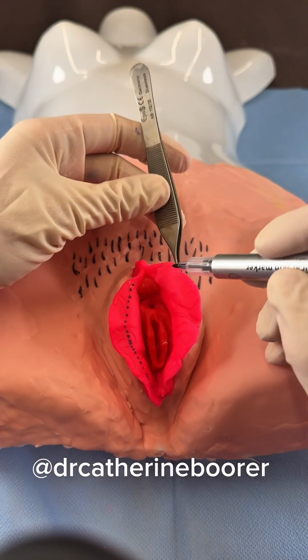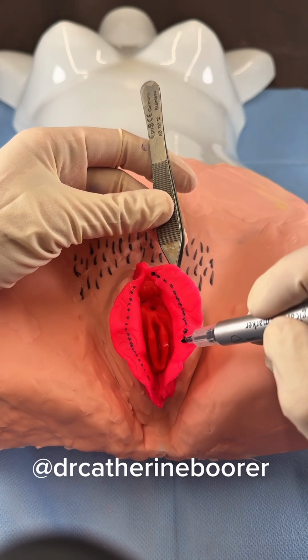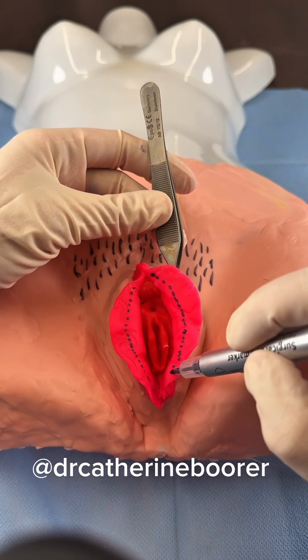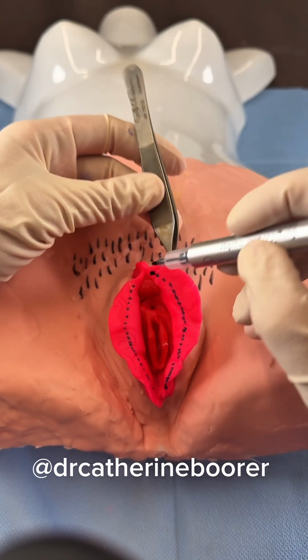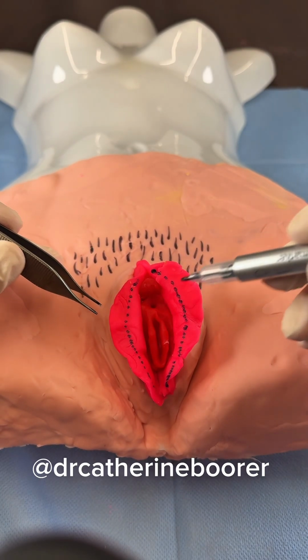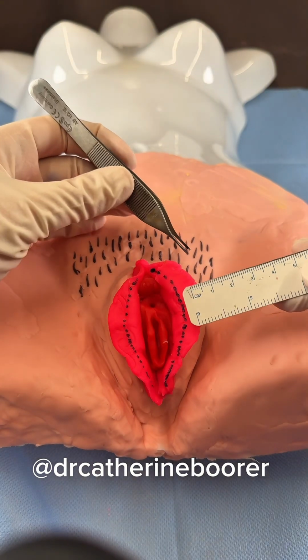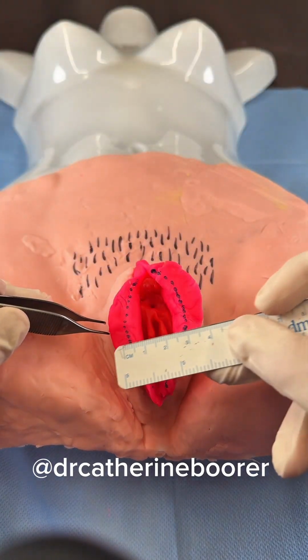First step is to mark where we're going to incise. And the aim of this operation is to take off enough labia minora so that the labia then equal with the labia majora. But I can't stress enough how important it is not to take too much labia minora, which is an absolute disaster. Before I go any further, I'm just going to double check my measurements just to make sure I'm taking the right amount off each side.